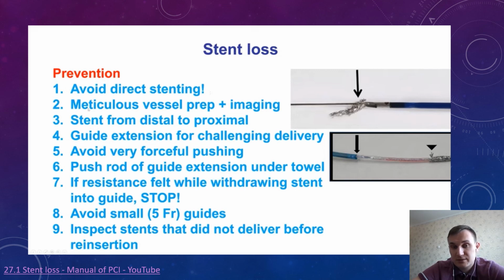And you should always inspect stents if you observe that you have some resistance during its delivery.